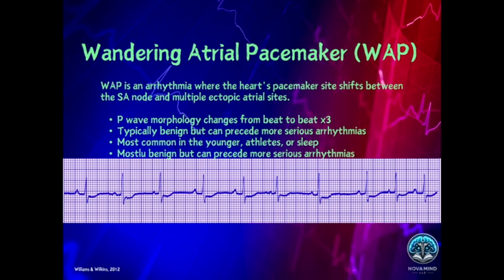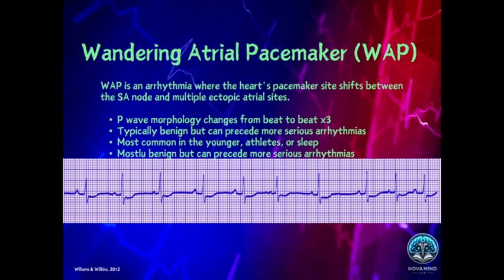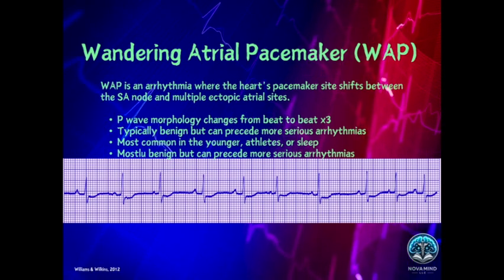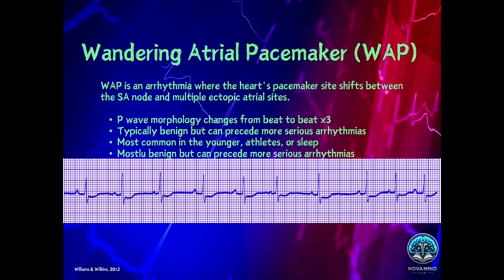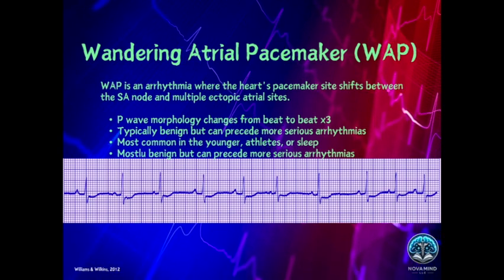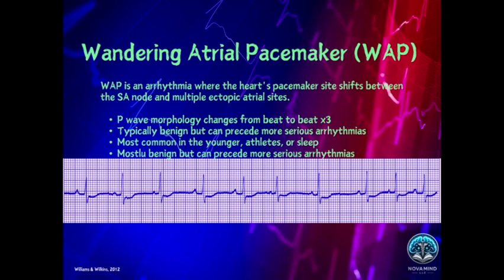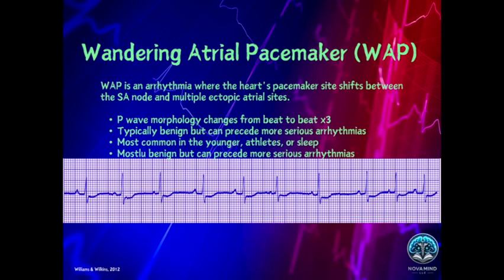This rhythm is typically benign and often occurs in younger individuals, athletes, or during sleep as a result of increased vagal tone. While wandering atrial pacemaker is harmless, it can occasionally precede more serious arrhythmias, especially if the heart rate increases significantly. It is important to differentiate wandering atrial pacemaker from more concerning conditions like multifocal atrial tachycardia or atrial fibrillation, which have a faster heart rate and may indicate underlying pathology.